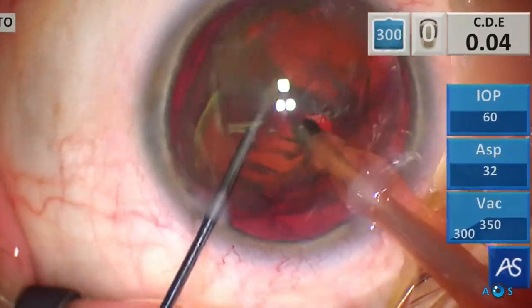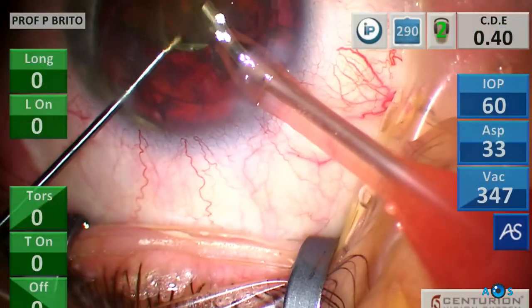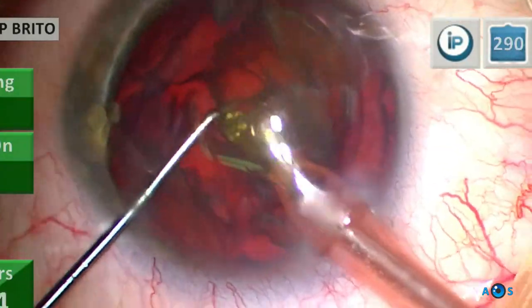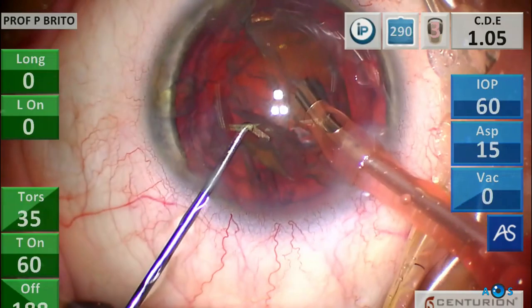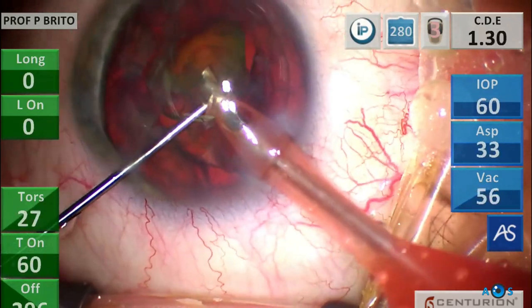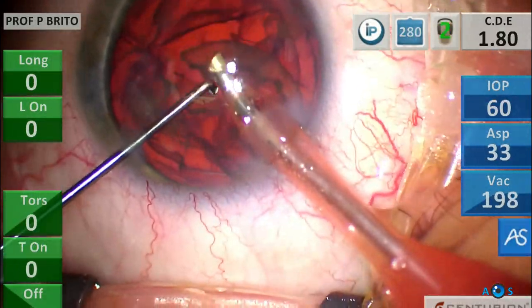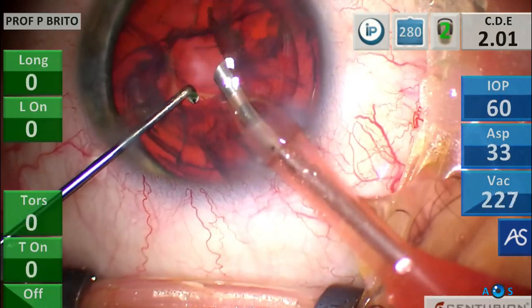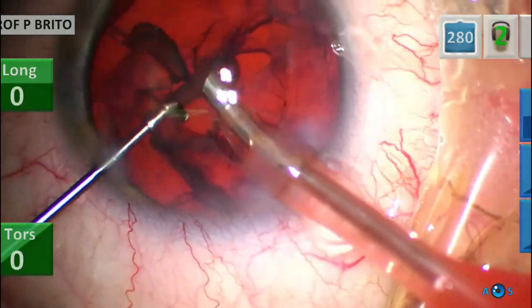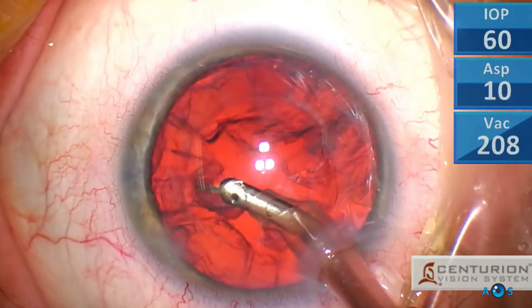The tilt and chop maneuver is an efficient technique to create two nuclear halves which will then be easily emulsified using low energy settings. The remaining nuclear half is now emulsified, always using the chopper to feed it into the phaco probe and to protect the posterior capsule. The epinuclear shell is now carefully peeled and aspirated. Now switching to the IA probe to aspirate the lens cortex using round sweeping motions.